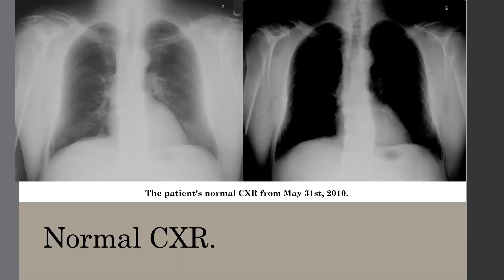Going back to the patient — this is his chest x-ray from 10 years ago, May 31, 2010, and it is normal. Two important things to note: the outline of the vertebral column is clearly visible, and behind the heart you can see only vasculature.